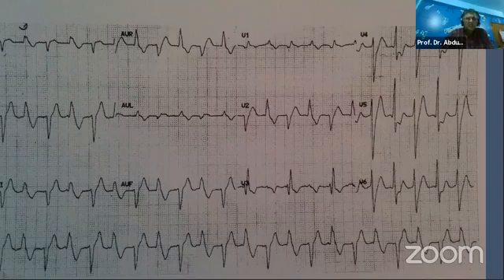Another idea, yes sir. That this is a complex ECG, and we want to show you how you can dissect it step by step and find out somewhat near the truth. I was saying there are several possibilities. Another thing we want to teach you in ECG, as one of our mentors, Professor Rafiq sir, always saying, there could be several correct answers.